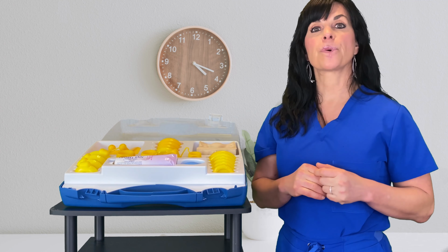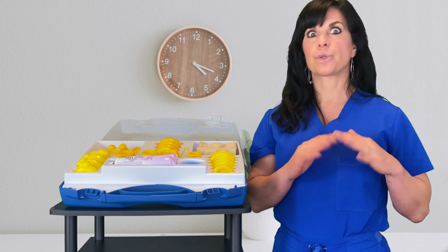Another candidate would be someone who just really does not want surgery because they fear it, or they would just rather do conservative measures. Another reason would be someone who's got a lot of medical problems that would not be conducive to prolonged anesthesia. Or someone who is delaying surgery for, let's say, getting a workup to be healthy enough to have surgery, or because you don't have time off until the summer or Christmas, things of that nature. So those are going to be the primary women that will undergo a pessary fitting and trial.